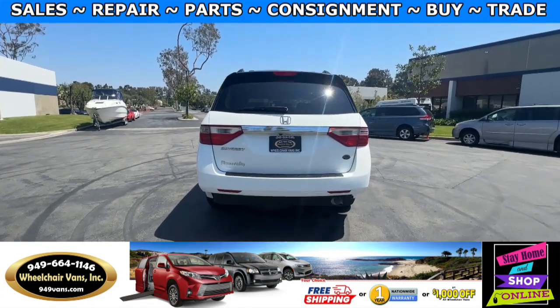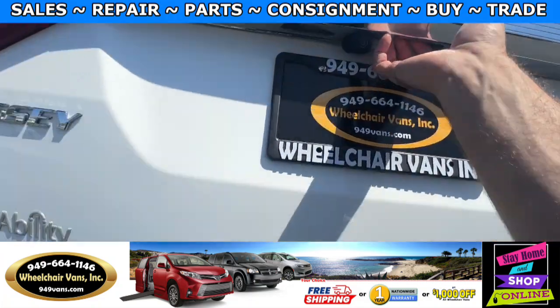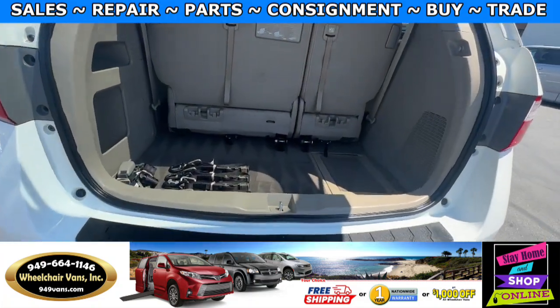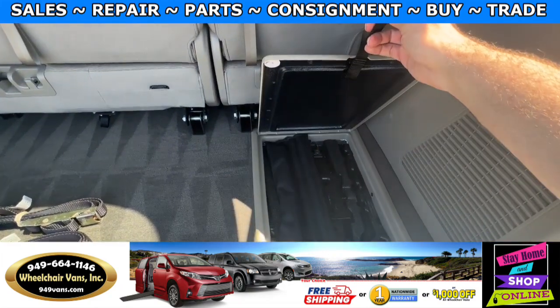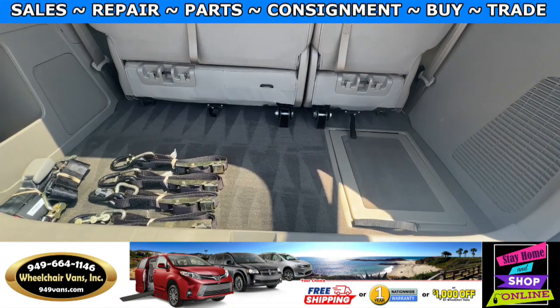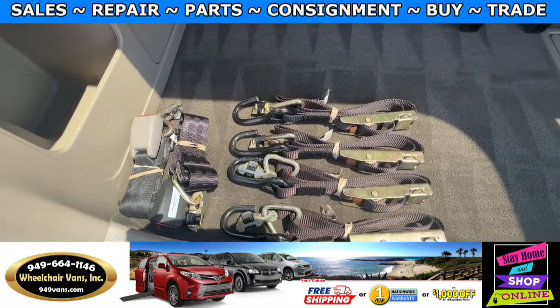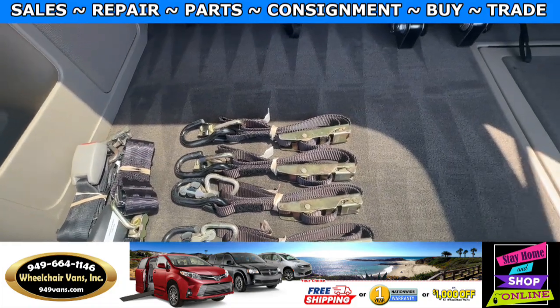Let's go ahead and open up the rear hatch. This is going to have a backup camera. In the back you will have the tools for the spare tire, and the spare tire is located underneath the vehicle. As you can see, we provide everyone with a set of manual straps.